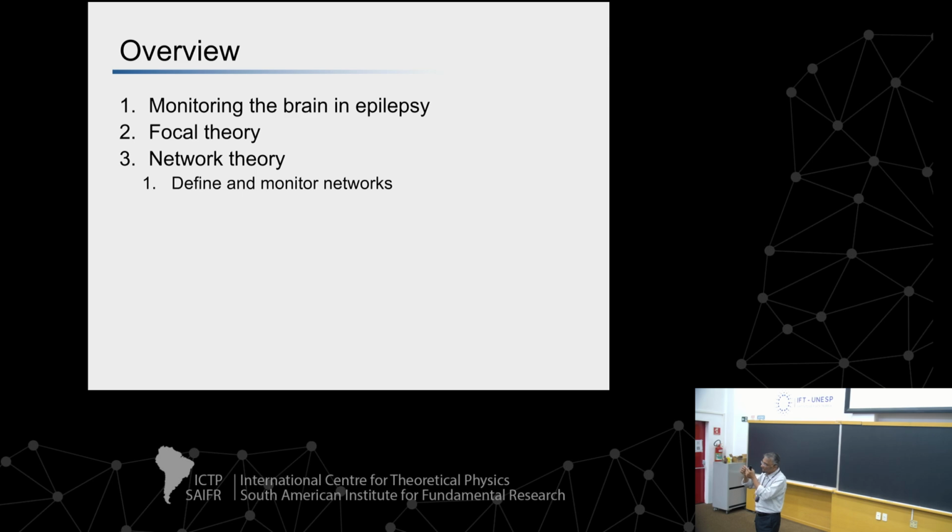But keep in mind, these are narrow, catheter-like constructions where the electrode is a ring on the outside, quite large. The exposed part in touch with the tissue could be 4 millimeters or so in length. So you're getting very macro signals, and sometimes you need to really understand exactly where you are in the hippocampus, because there's distinct circuitry at different parts. So it's not as well done as in an animal study, where you could much better target subfields of interest in the hippocampus.